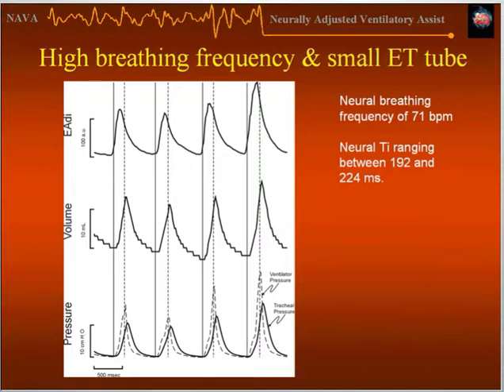Now, what is the response of the system? We talk about physiological response. The green lines here indicate the onset, in this bench study, of when the neural trigger signal triggers the ventilator, to the time that the pressure starts to get delivered. And we have a very short delay here. Practically, the time when the pressure starts to increase at the mouth is approximately the time when the diaphragm starts to generate flow at the mouth too. So synchrony is very good.